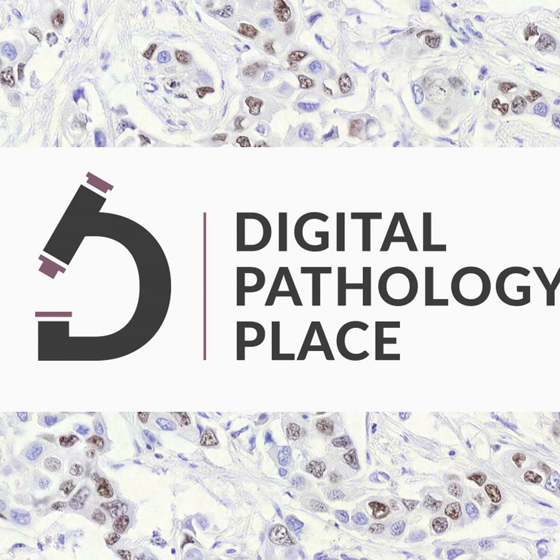And I was wondering why my AI model doesn't work at all according to ground truth. So it was basically a hard lesson that pathologists sometimes normalize the scales. The most severe fatty liver can have 90% fat. But actually, if you calculate the pixel areas, it's 16%. Because between the fat cells, there's a lot of tissue.